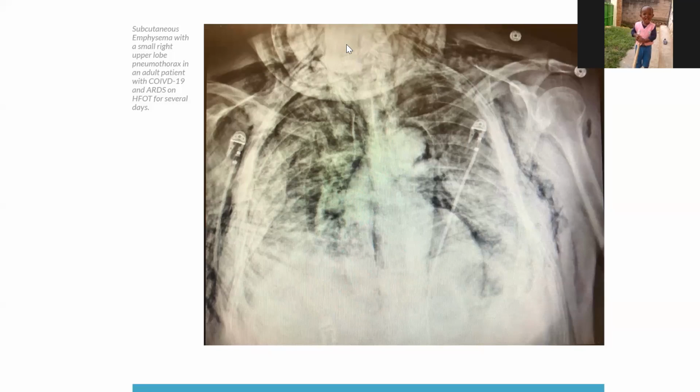For the contraindication, of course, this is something you put on the face of a patient. So the one you described, if someone has a facial malformation or other issues around the face. To help our audience to understand it, they can think about a simple nasal cannula, what should be the contraindication. This is what I want to compliment you. Thank you very much, Jean-Paul. That's very helpful.